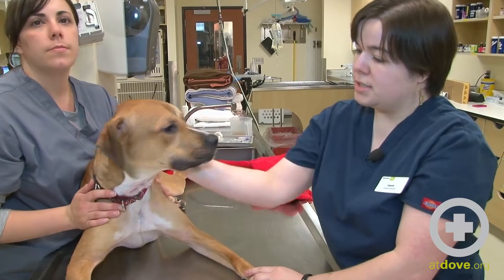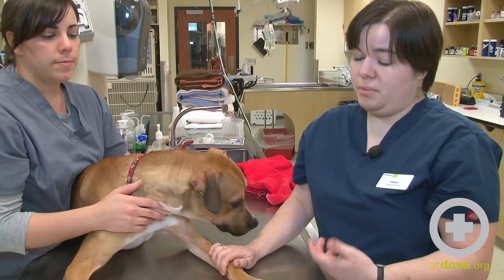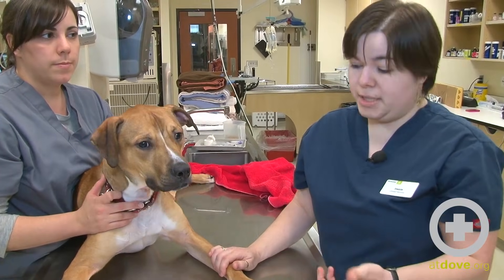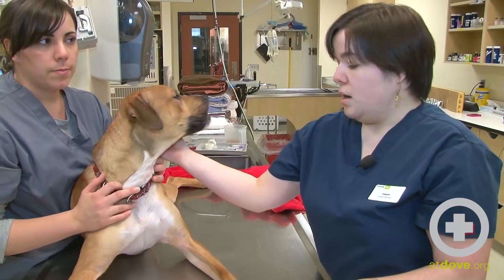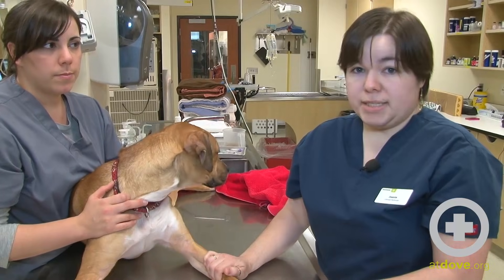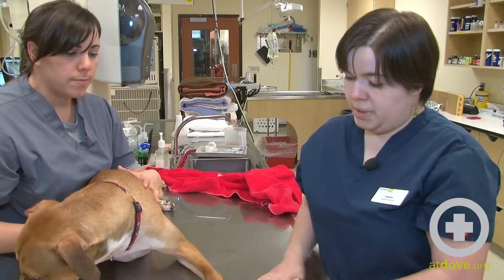Usually it's a patient that's a little bit more excitable, a little bit hesitant about restraint, or a patient that we aren't going to need to place an IV catheter. This patient we're just doing some screening blood work, so we aren't going to be placing a catheter today — we're just going to be sending out blood work, so it's just going to be a quick, easy place to draw some blood.